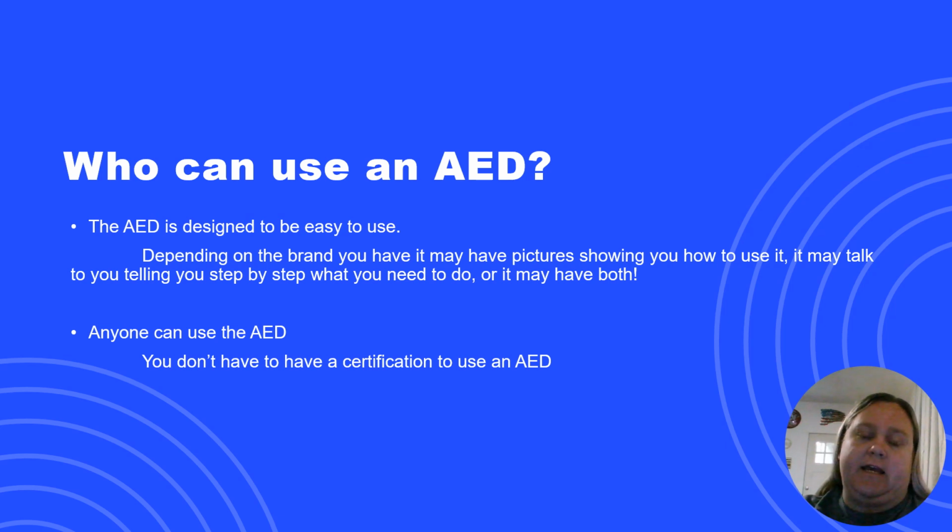Who can use an AED? A lot of people think that an AED is only for those who have some type of certification, whether it be CPR or EMR, EMT, paramedic, doctors, nurses, but that is not the case. The AED is designed to be easy to use. Depending on the brand that you have, it may have pictures showing you where everything goes and how to use it and what buttons to click. It may talk to you and tell you every step of the way what to do. Or in some instances, it may have both of those things. It may talk to you and it may have pictures.